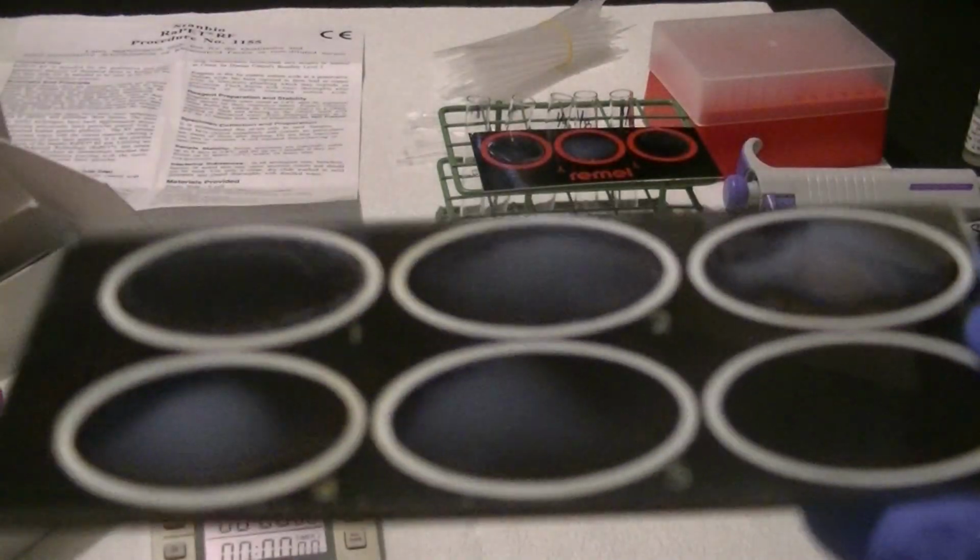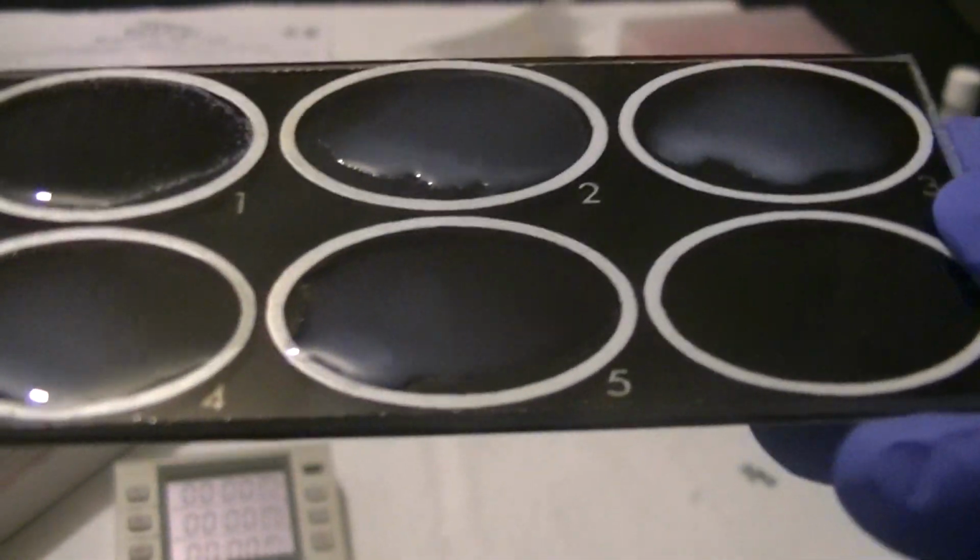However, the 1 to 4, the 1 to 8, and the 1 to 16 are negative. So I would say that this person has a semi-quantitative amount of rheumatoid factor that is a 1 to 2 titer, or a titer of 2.